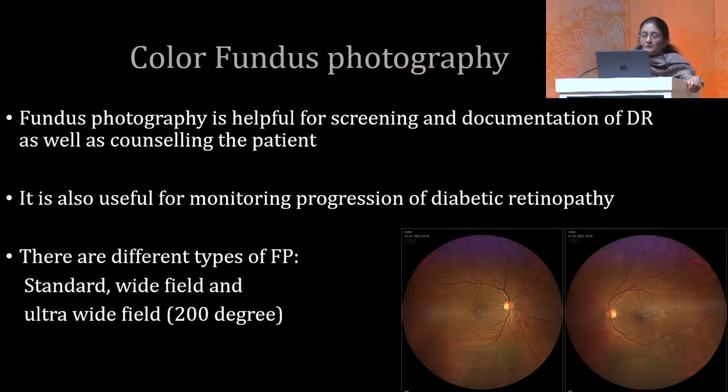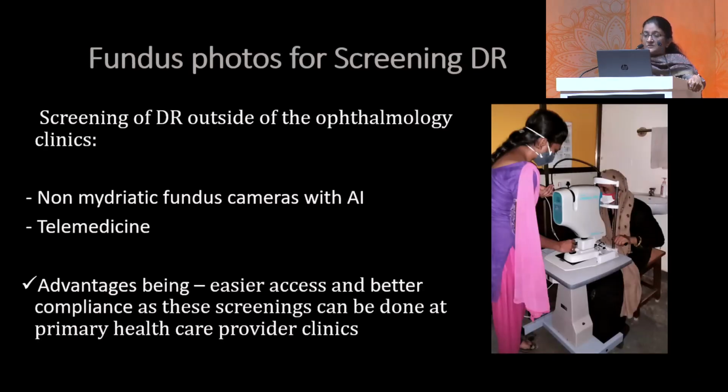A simple color fundus photograph is extremely important when you want to screen a patient for diabetic retinopathy, and it's also important to document what stage of DR you are dealing with so that you can properly counsel the patient for further management. It is also useful for monitoring the progression of DR, and there are various types of fundus photographs available in today's time.